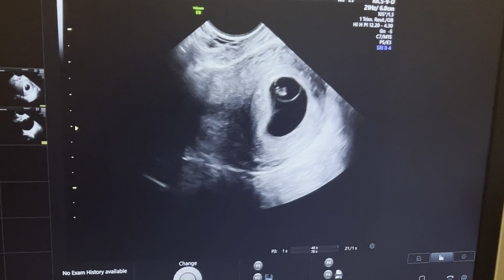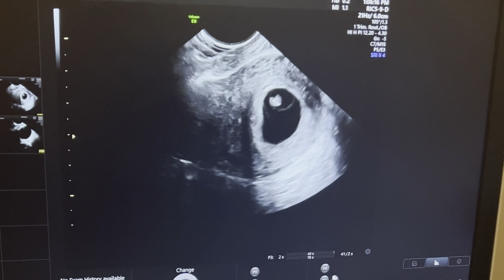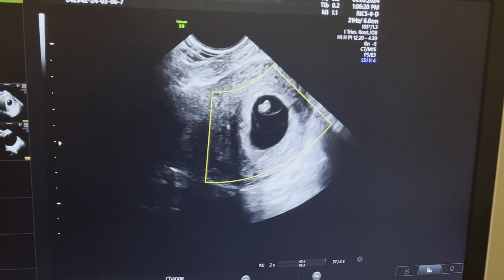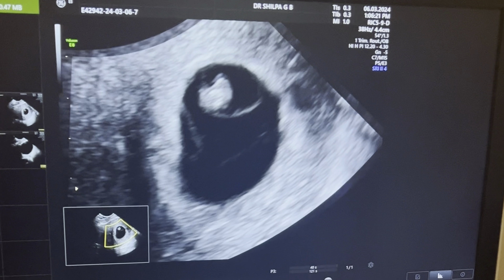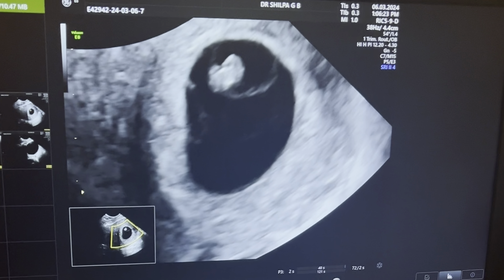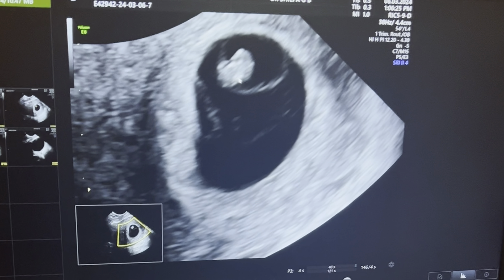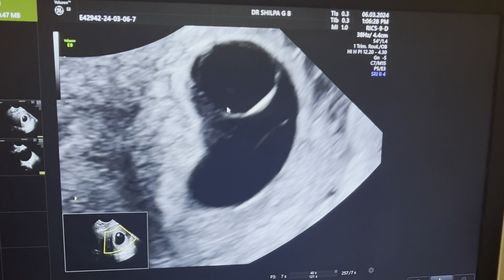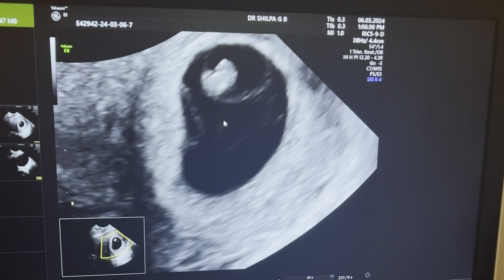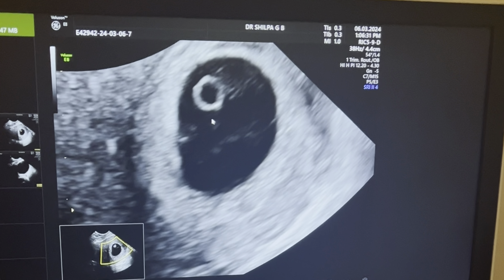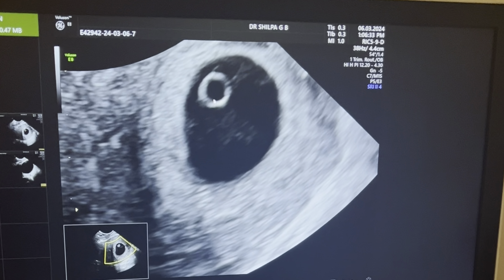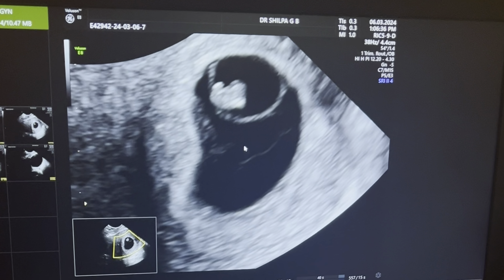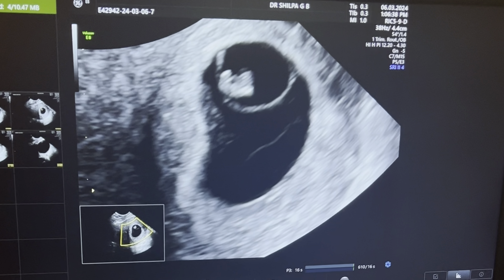This is a transvaginal ultrasound for missed abortion. Once you look at the pregnancy in the sagittal plane, you put the zoom-in box and zoom the image. This is the fetal pole where the arrow is showing. This is the amnion — we should not confuse it with the yolk sac. The yolk sac is always outside the amnion, and this is the yolk sac. The gestational sac seems to be regular here.